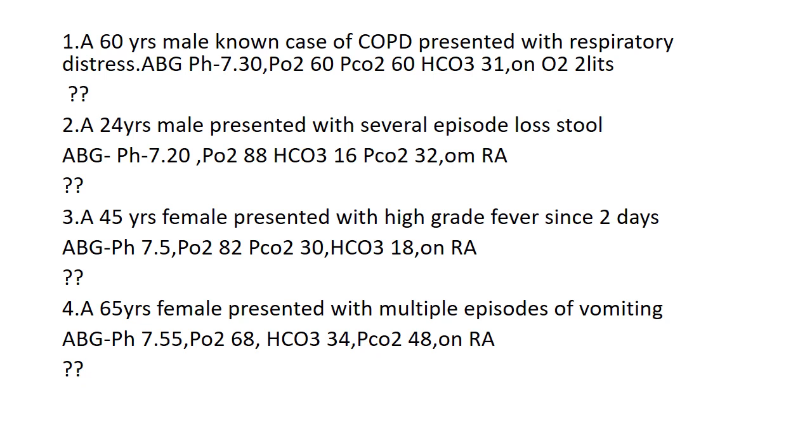And if you see, the PO2 is 68 in room air. So if you do the PaO2 to FiO2 ratio, it is 68 divided by 0.2, so it will be less than 400. We say that 400 to 500 is normal, so a PaO2/FiO2 ratio less than 400 means the patient is hypoxemic. Got it?